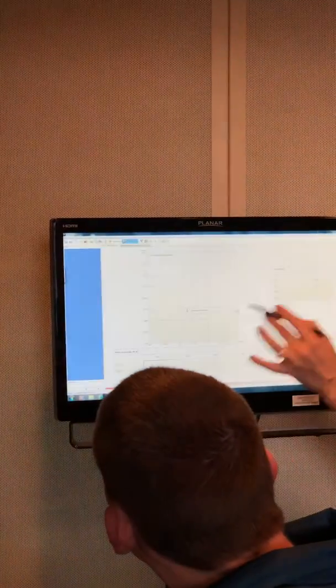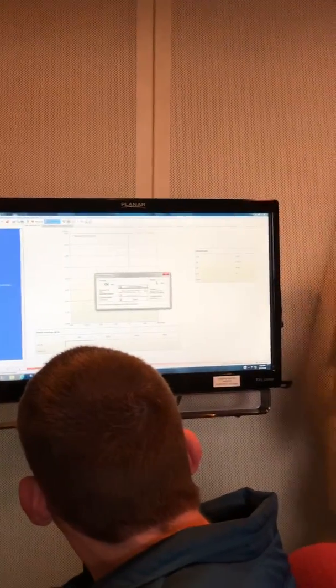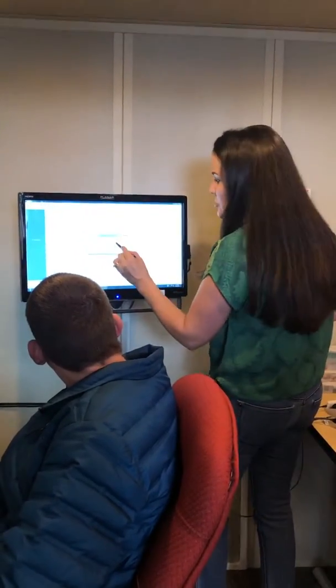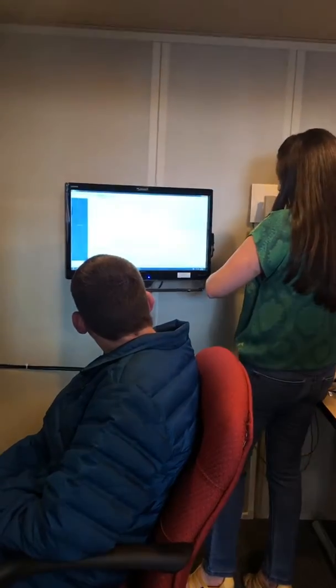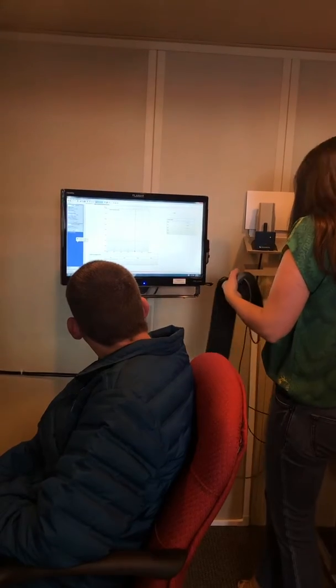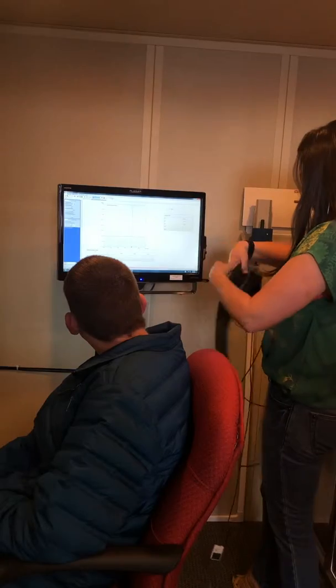I hit control panel to start connecting, then click 'create new session.' You won't have to do all of these steps because this was just from the very beginning. But you will need to do 'create new session' when you get into the file — just remember to pull up your patient file, go into otoflex, and then create a new session.